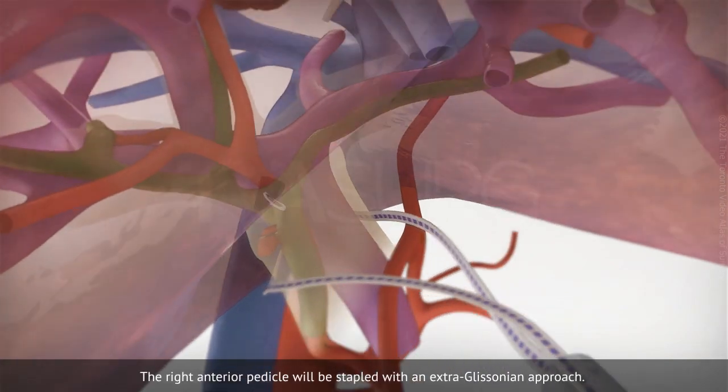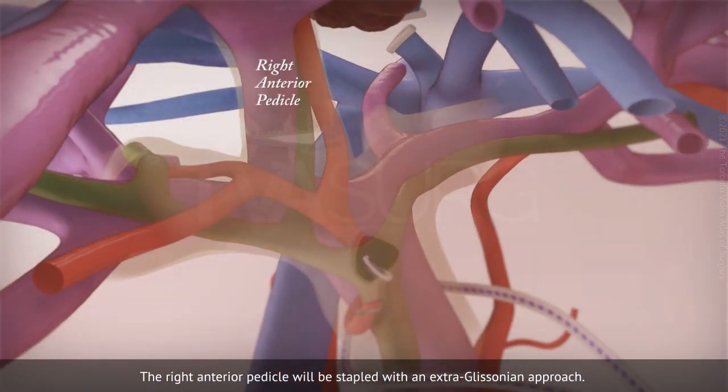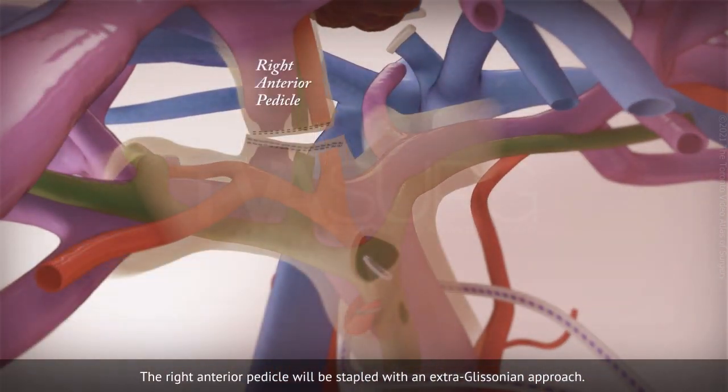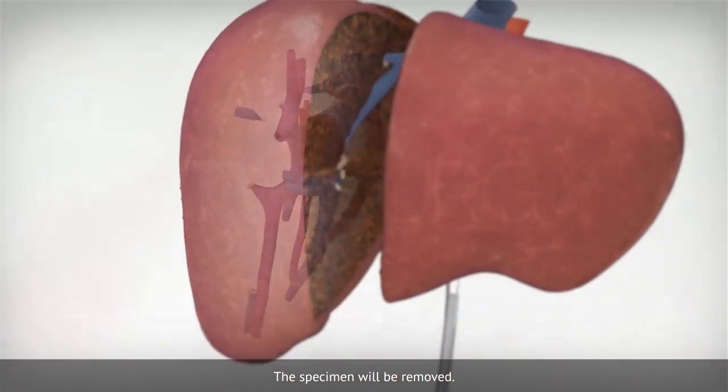The right anterior pedicle will be stapled with an extraglissonian approach. The specimen will be removed.